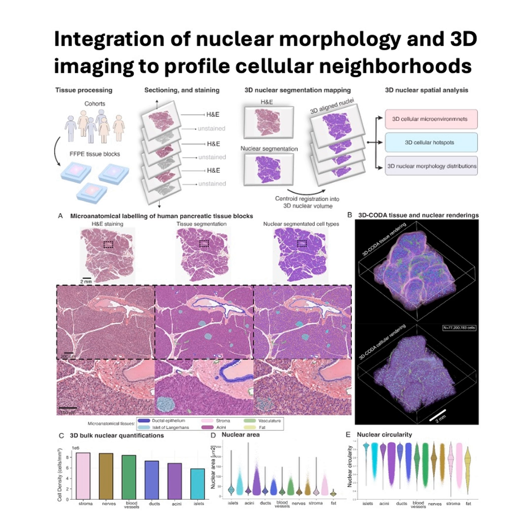Interesting. What about other cells? Well, take acinar cells. They showed a more homogeneous size distribution, less variation in size compared to islet cells, still quite circular, but a bit smaller on average than islet nuclei. And other tissues? Cells in blood vessels, nerves, the ducts, the stroma. Yeah. They generally showed intermediate levels of heterogeneity in both size and shape. So each tissue type really had its own characteristic nuclear profile in 3D.